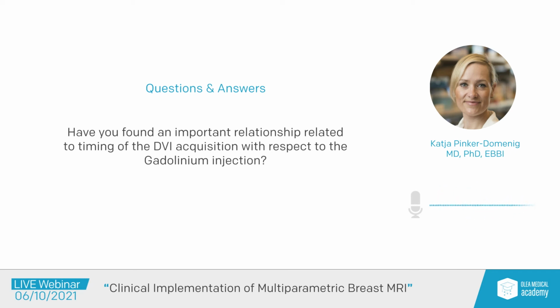So whatever works in your institution. There have also been some interesting concepts, where I could do a DCE MRI first-pass imaging in the sense of an abbreviated protocol, do my first minute, then do a DWI, and then do one sequence delayed. Currently that is not within ACR accreditation, but it's an intriguing idea. Yes, there is an impact, but it's not diagnostically relevant. If you go by the books, I would recommend doing it before contrast agent application.